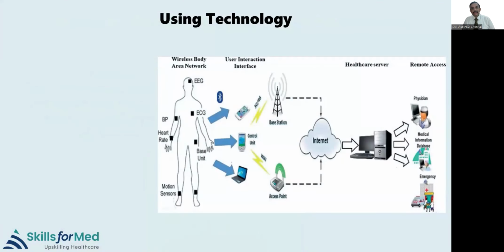So that brings us to the end of the errors which happen in all the vital signs, including pain and capillary blood glucose measurement. I want to end with pointing out that technology is now in place where you could do the measurements accurately and also get the values directly into the electronic medical record system. It's available as of today. It is not a future technology.